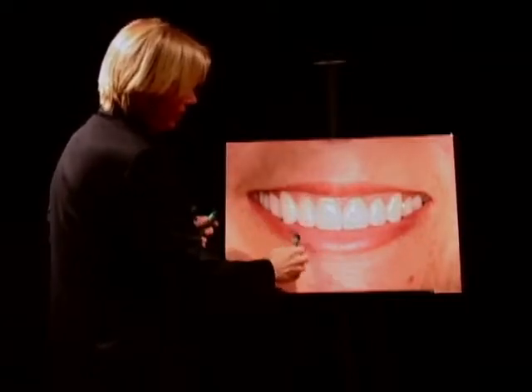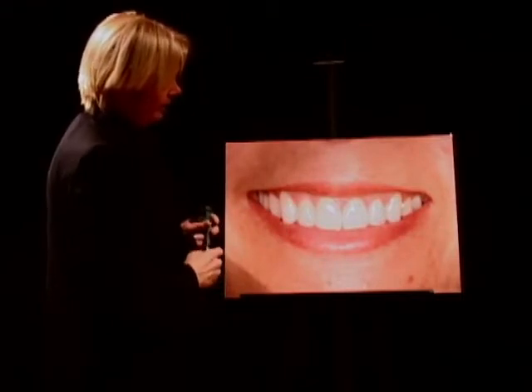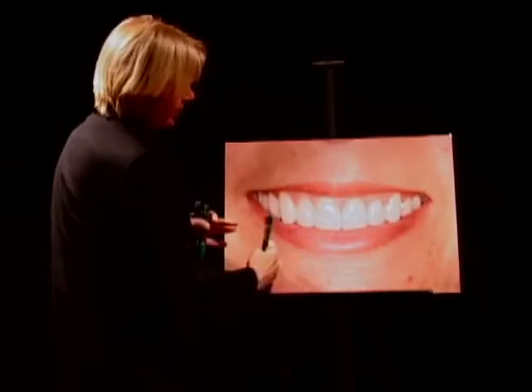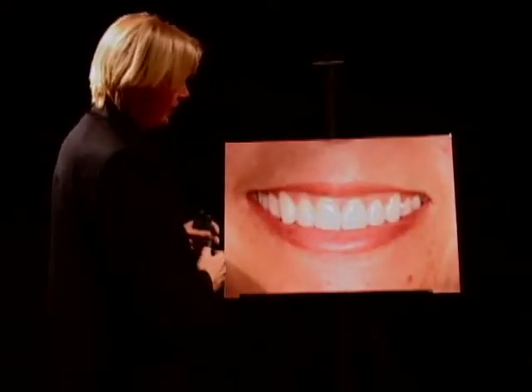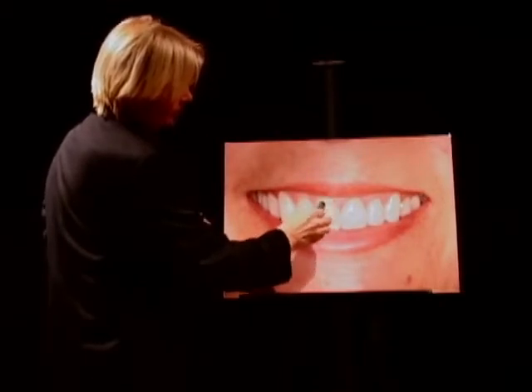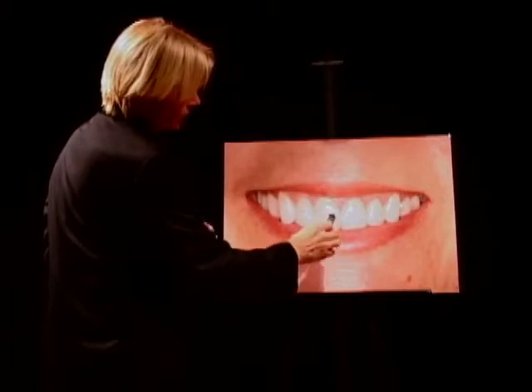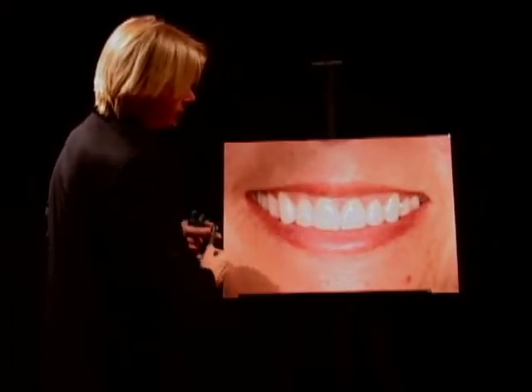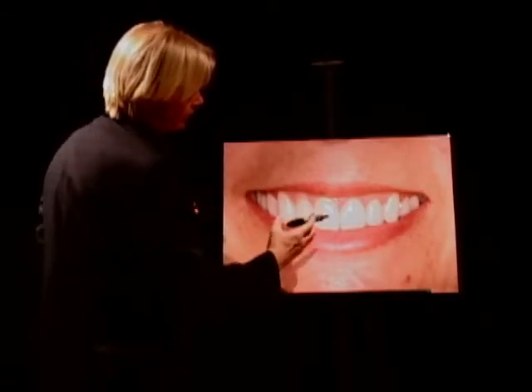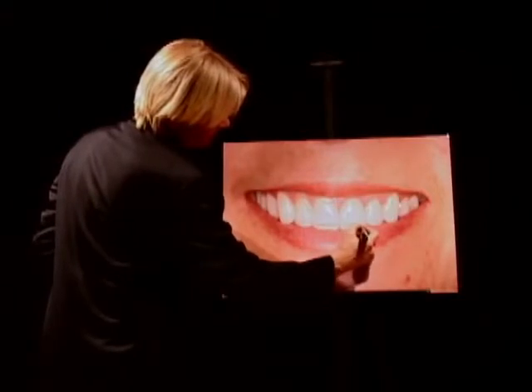We have a proper length of those teeth without impinging on the lip. The canines are riding on the lip. It also depends on the smile, how wide and how bright the smile is. There's polychromaticity. From here you can see more yellow areas and then transitioning into a more bluish grayish area here, which is basically caused by the translucency of the porcelain in this area. So we have the translucency here and we have translucency here.